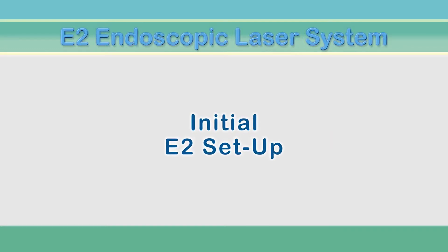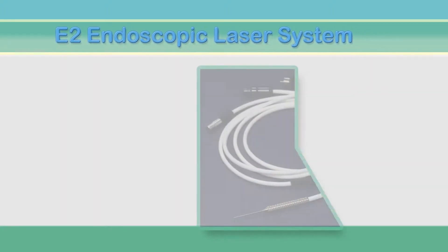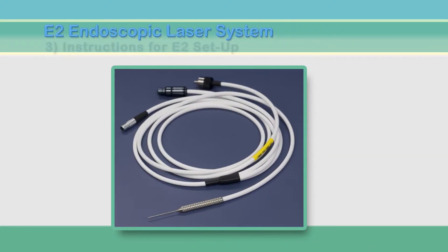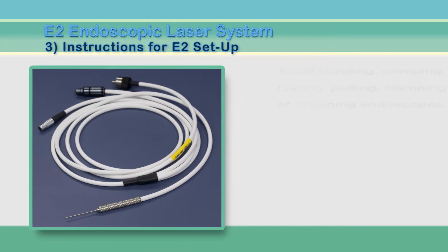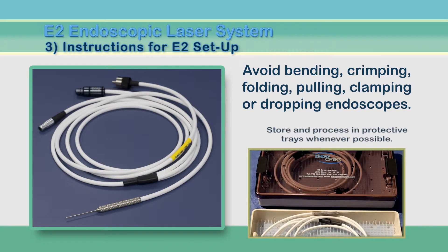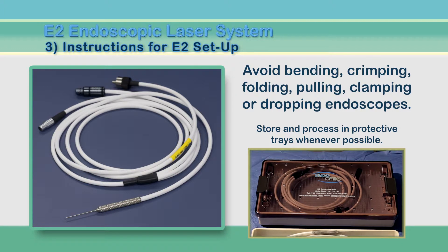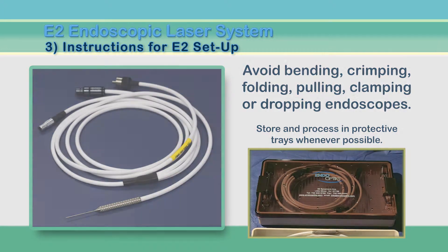Setting up your system is really a simple process with a few important considerations. Before starting, we must stress the need for great care when handling the endoscopes. The flexible cables contain fiber optic bundles that can easily be broken if bent, crimped, folded, pulled, clamped, or dropped. We recommend whenever possible that they be stored and processed in protective trays.